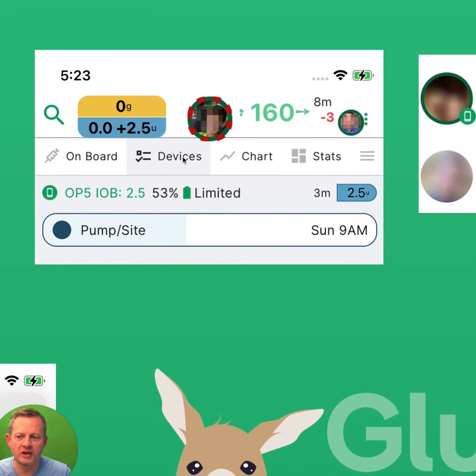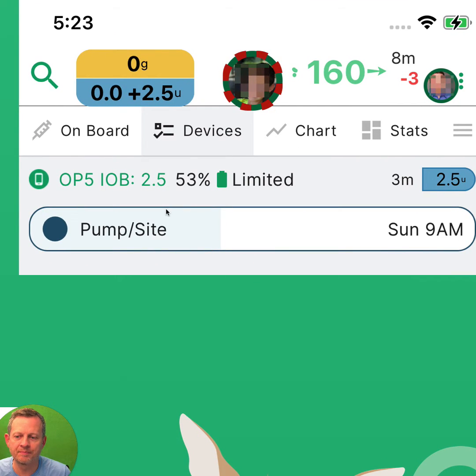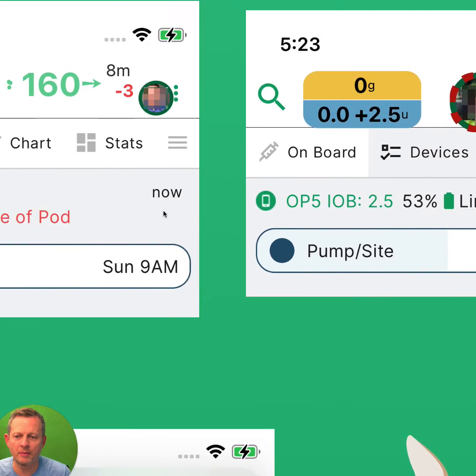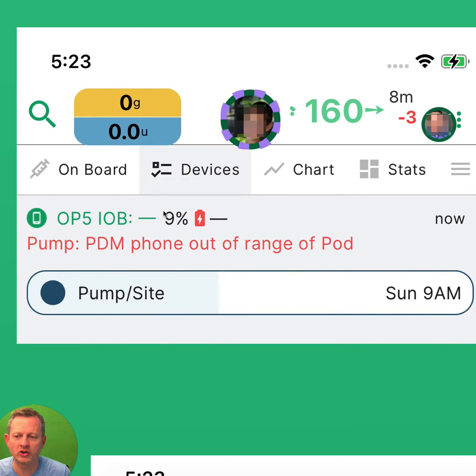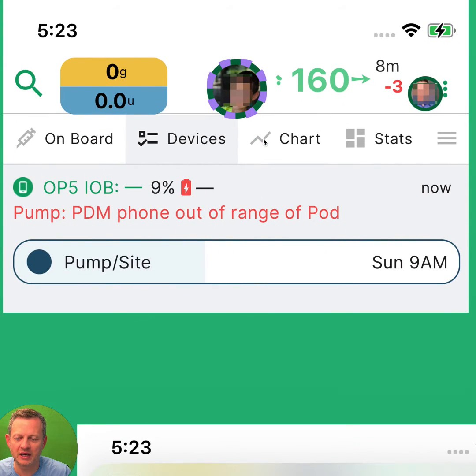If the pump switches to limited mode, you'll see a header change to look something like this with a life preserver around the person with diabetes. And if the pump and phone are no longer in communication, you'll get a warning message like this and the life preserver will turn purple and green, showing the PDM is out of range.